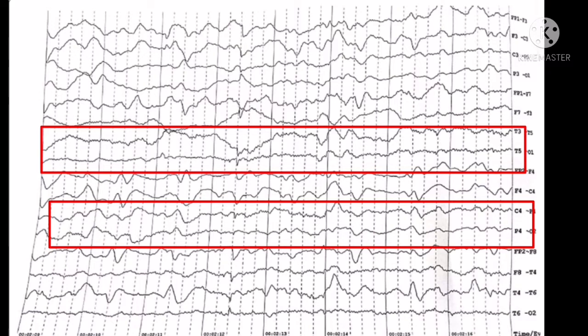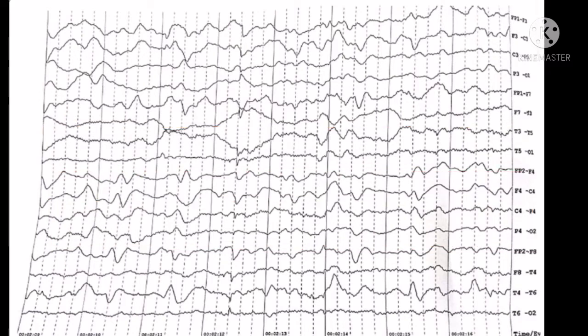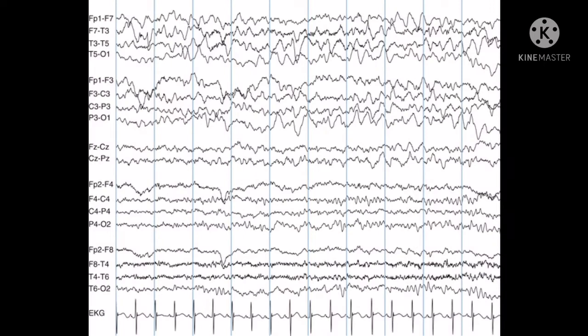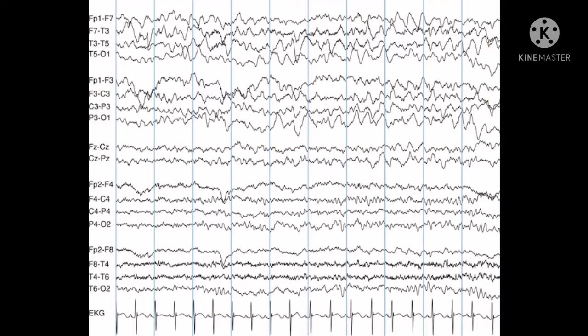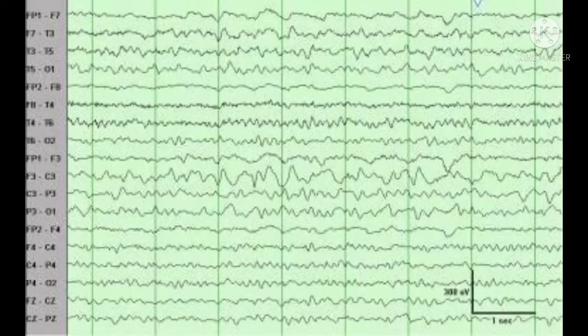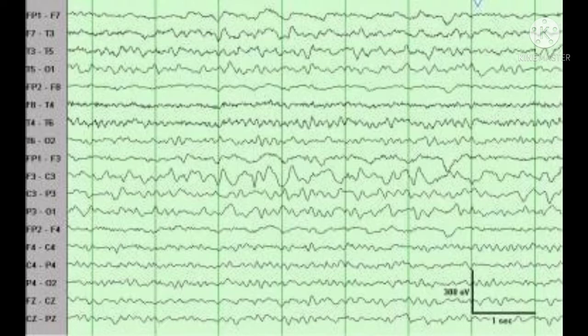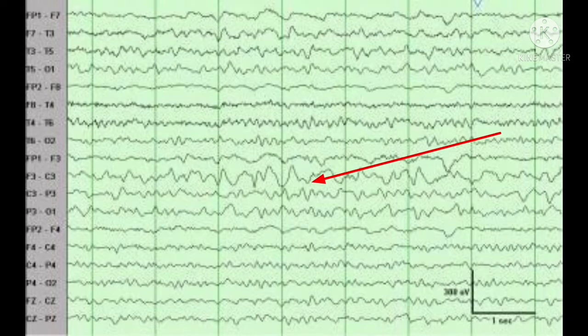Sometimes we have regional slowness. Regional slowness may be due to structural lesion or area of encephalitis or sometimes in encephalopathy. Sometimes the slowness may be focal. This is usually due to structural lesion. Include focal theta activity or pleomorphic delta activity.